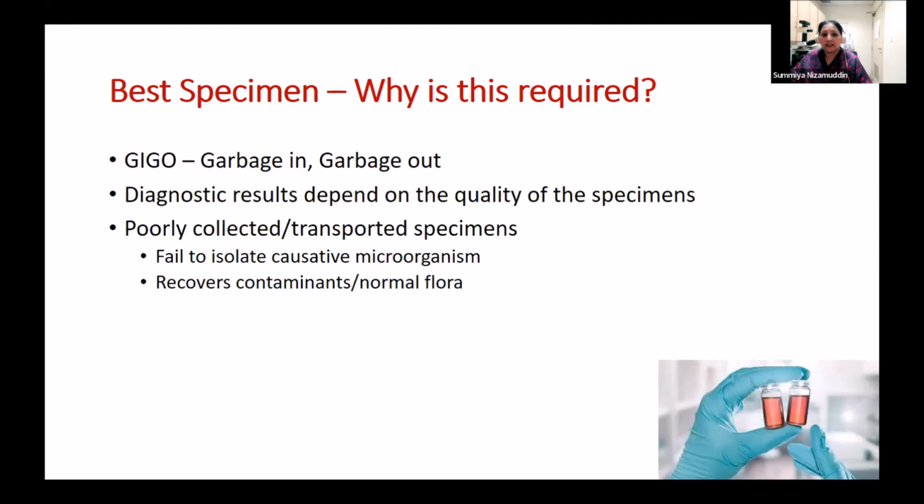Diagnostic tests entirely depend on the quality of the specimens that are submitted. Poorly collected or transported specimens will lead to failure of isolation of the causative bug. And of course, if the sample is contaminated with environmental organisms or with the normal flora, that's another reason why we won't be able to isolate the bug that is the actual cause of infection.